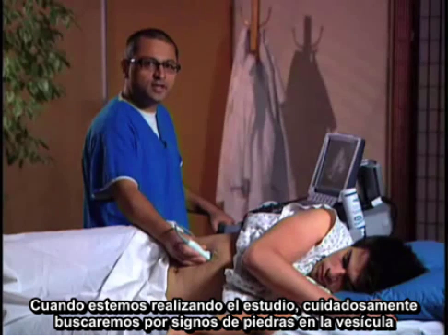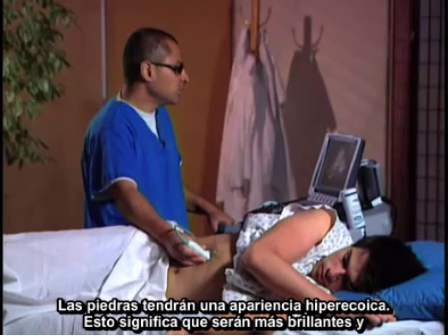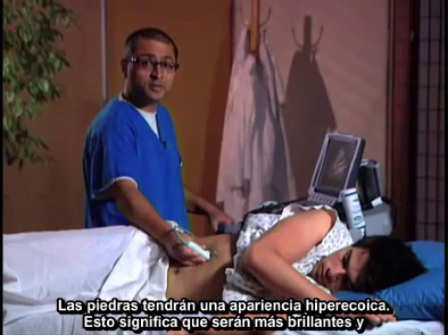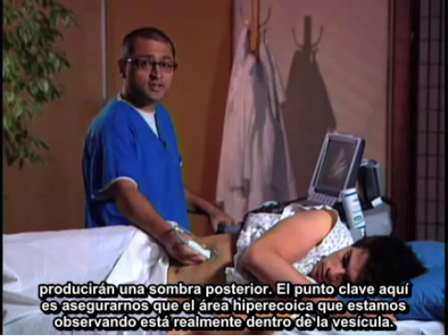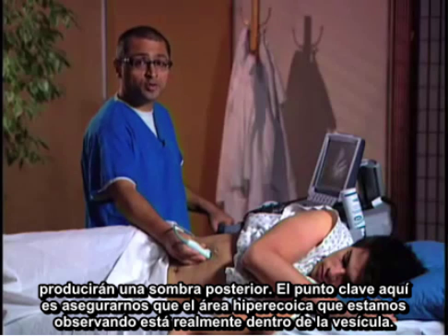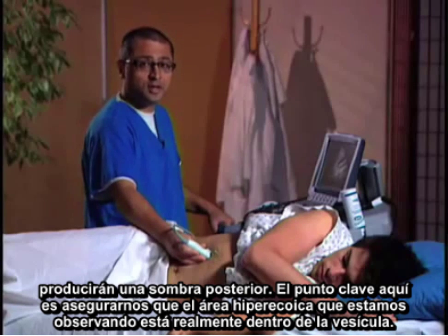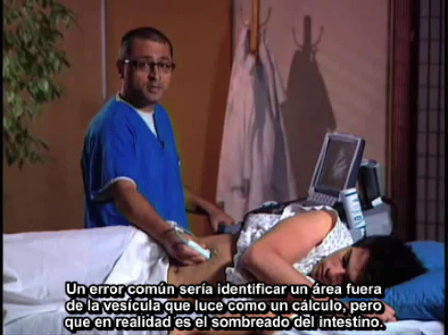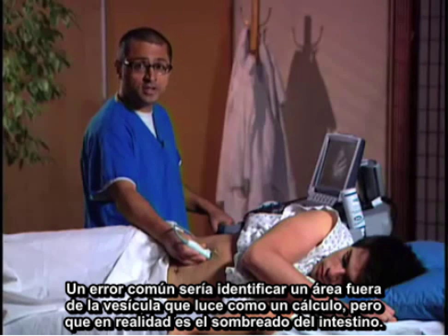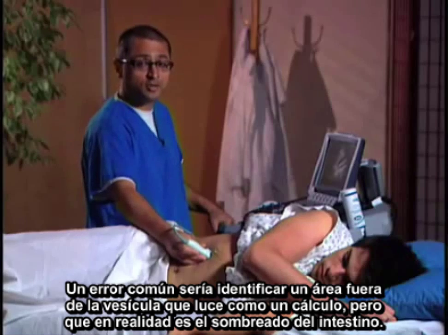When scanning, carefully look for signs of a gallstone. A gallstone will have a hyperechoic appearance — meaning it's brighter — and it will cast a shadow. A key point: make sure the hyperechoic area you're noticing actually lies within the gallbladder. A common mistake is identifying an area outside the gallbladder that looks like a gallstone, which would actually be a bowel shadow.